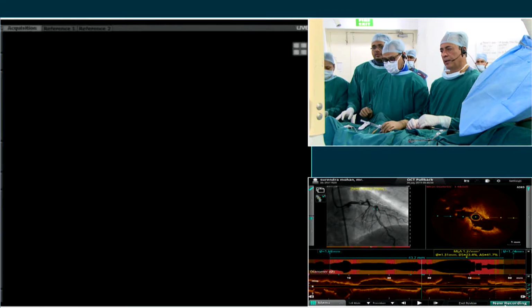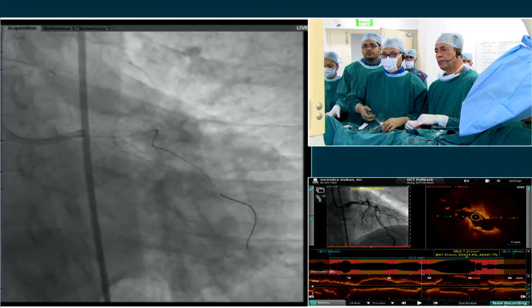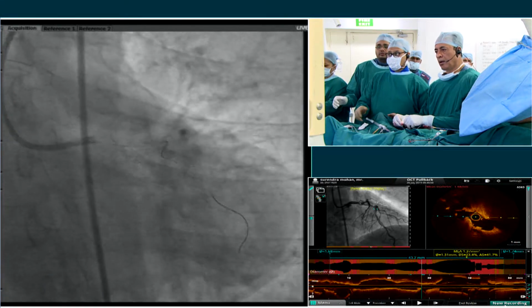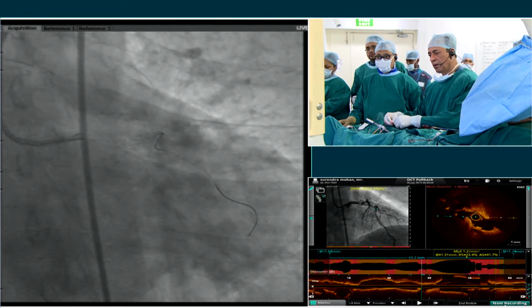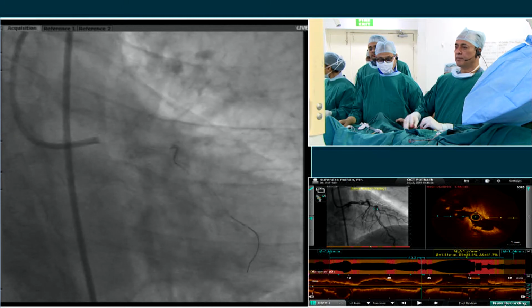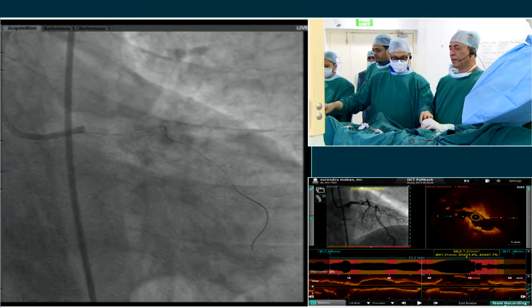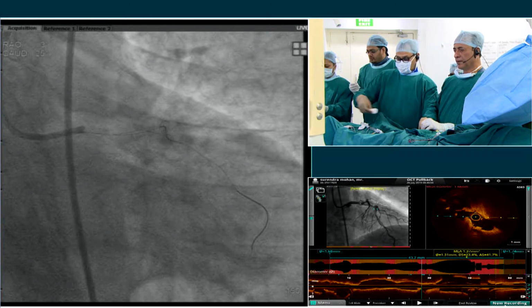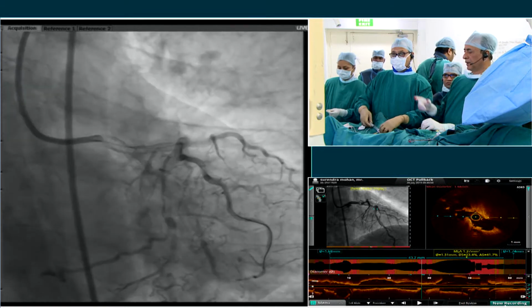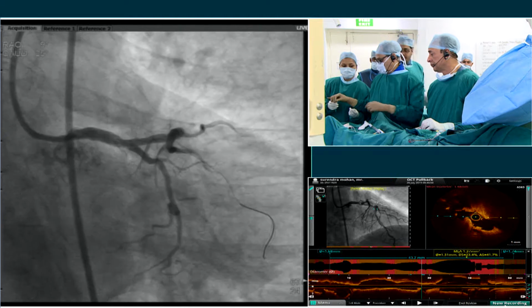Inject. Sorry to go back to my original point again, but I think if the left main is 4.5, and you know there's a huge OM that's occluded, then there's almost no way that the ostium of the circumflex can be smaller than 3.5 and even 3.0. So I understand that this will be able to be dilated and imaged, but typically speaking, if you think the left main's 4.5, then your LAD stent is going to be either a 3.5 or a 4.0, and your circumflex will be a 3.5 or a 3.0.